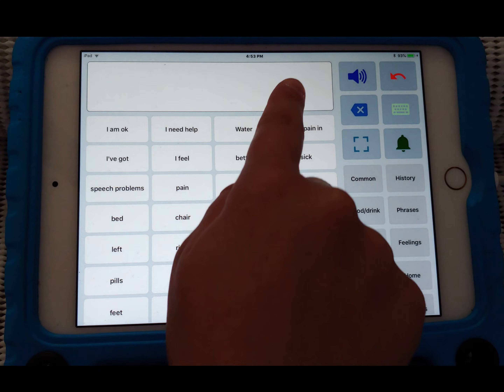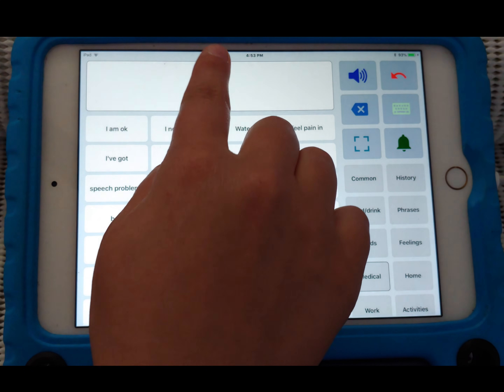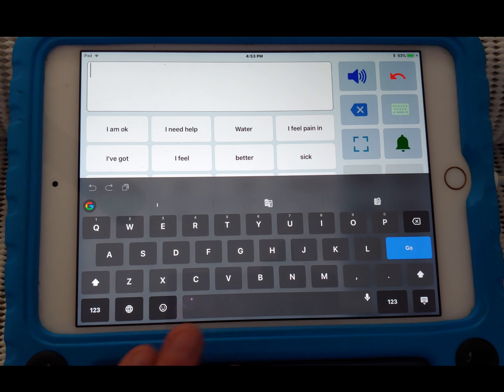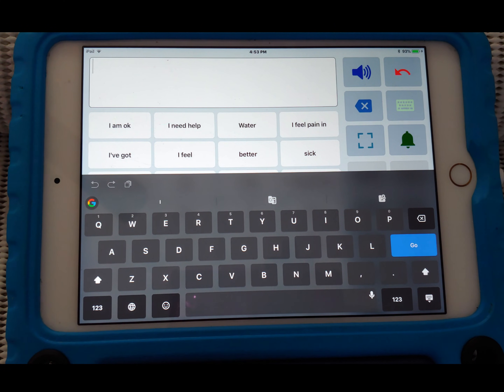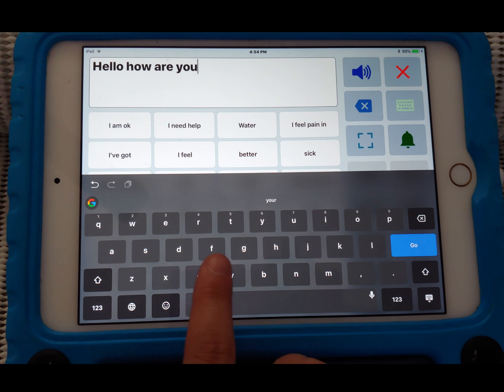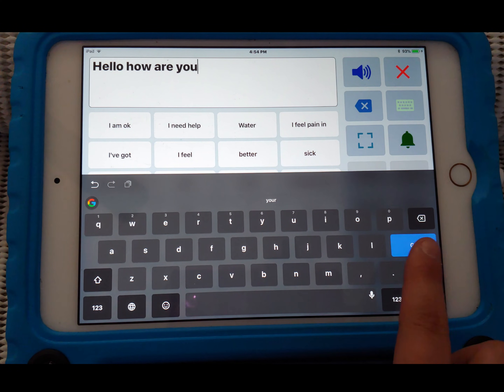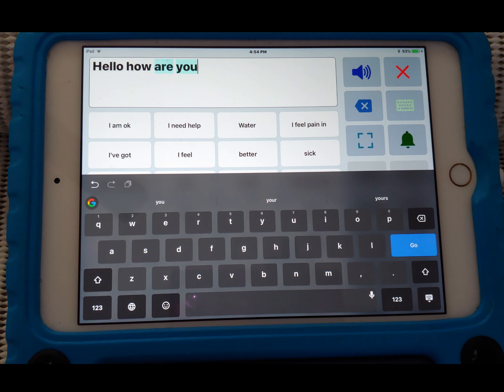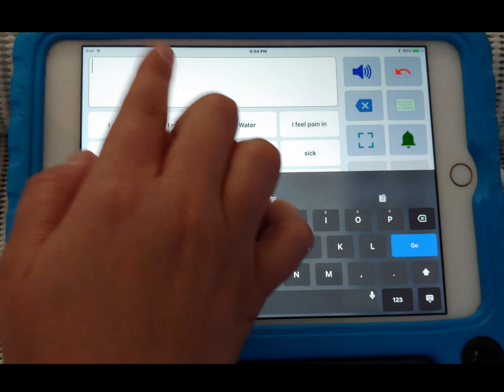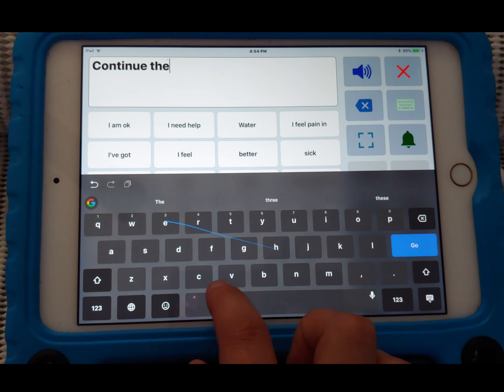You'll see that on the top left there is a text box — this white box here. If you click it, it opens up whatever on-screen keyboard you're using. I'm using the Gboard. As you type on the on-screen keyboard, the text comes up in the text box. I have it programmed so that when I hit go, it says whatever I wrote out loud and then clears it, so I can continue the conversation.